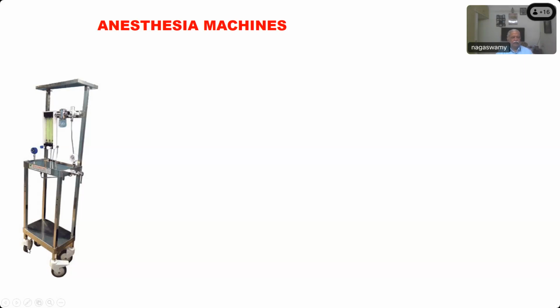Okay. The wheels that you have in your cycle or in your car, can they rotate all 360 degrees? No, sir. They can rotate only up to a particular limit. If you turn right, you may go up to 180 or 200, and if you turn left, you can go in the opposite direction. But these wheels are meant to rotate 360 degrees so that you can push the machine in any direction in the limited space of the operating theater.